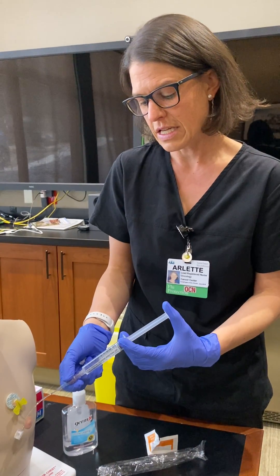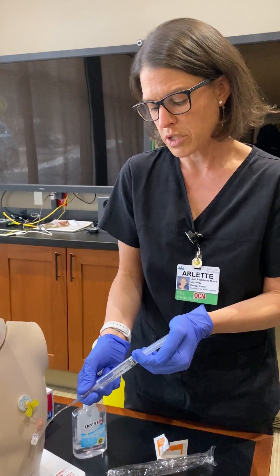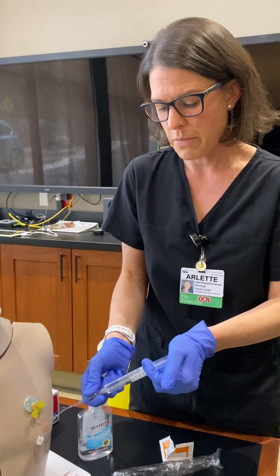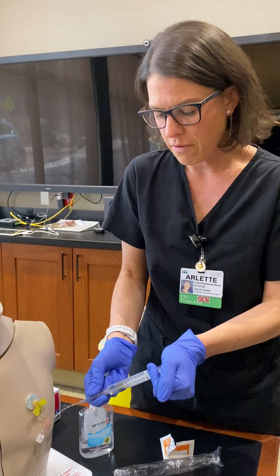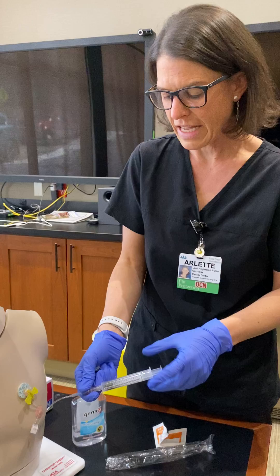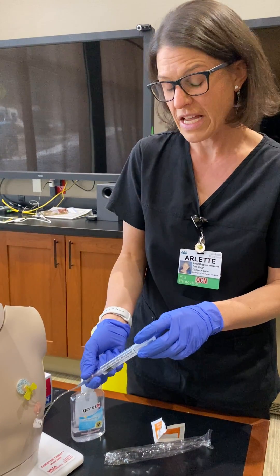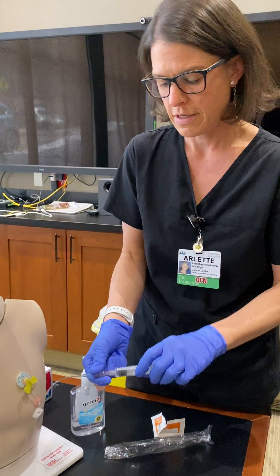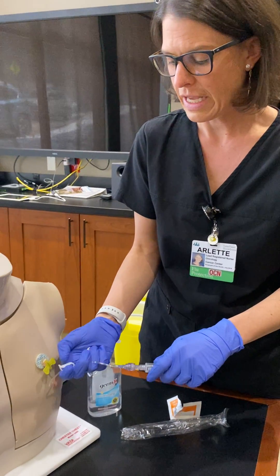Like we did with troubleshooting, you use that push-pause, pulsatile technique — so you're using quite a bit of pressure every ml. You'll want to do 10 to 20cc's of that pulsatile push-pause motion, and then clamp the line.